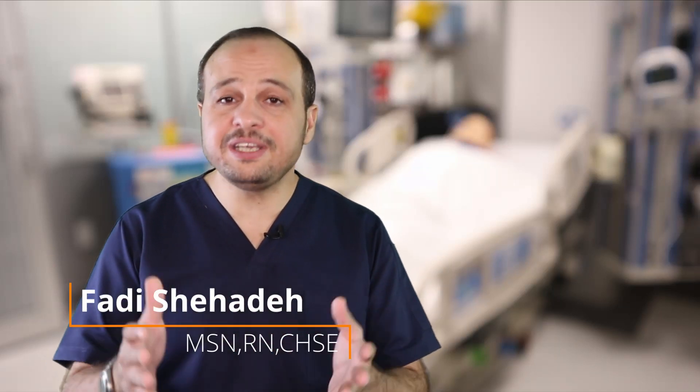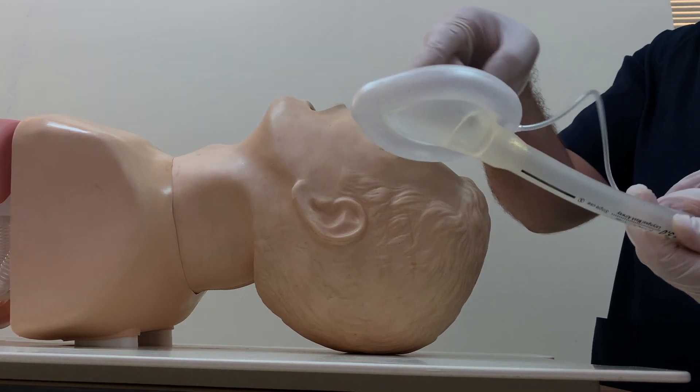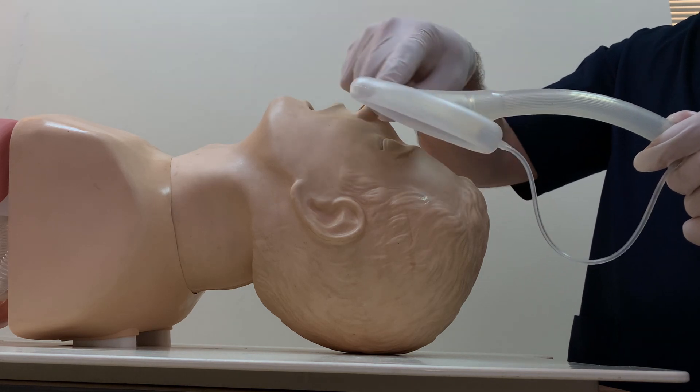Studies have shown the laryngeal mask airway, or LMA, is effective like the endotracheal tube. In this video, we will demonstrate how to insert the LMA. A laryngeal mask airway resembles an endotracheal tube with a spoon-shaped mask at the end.